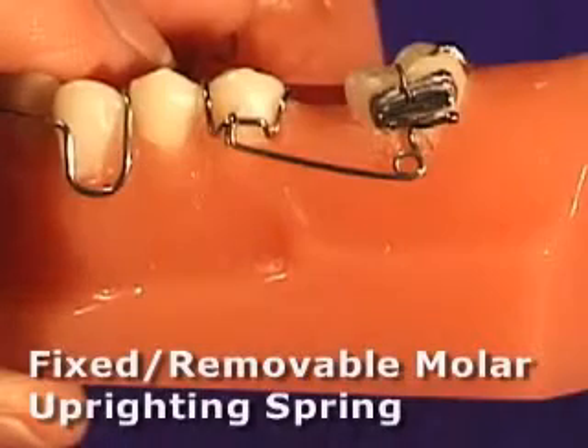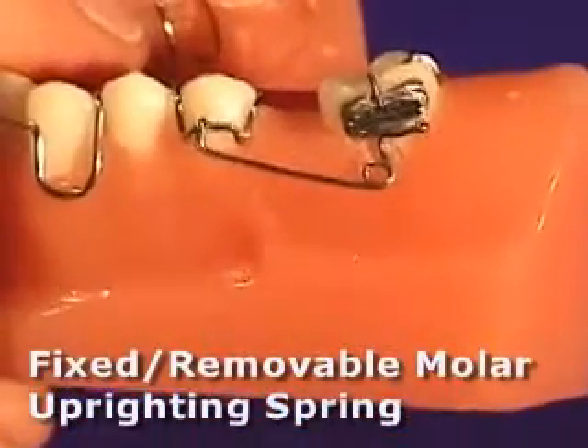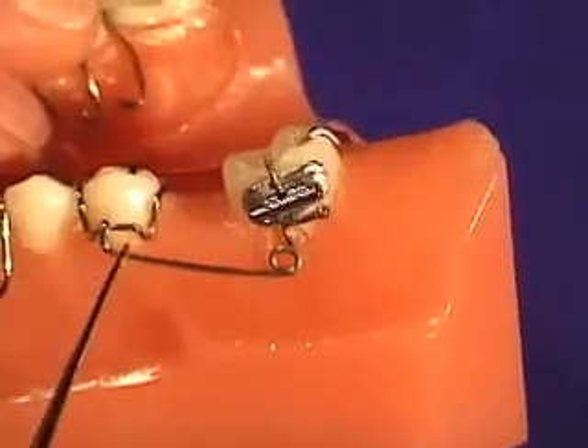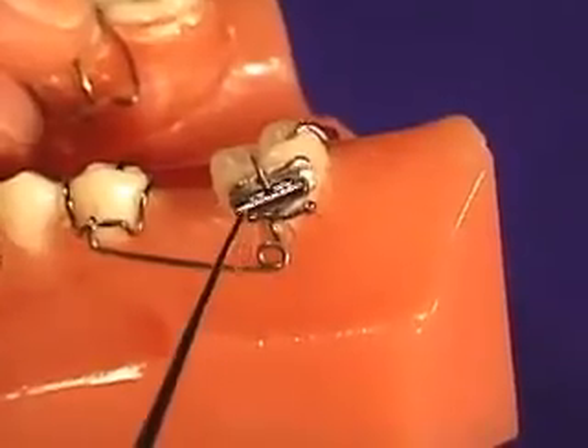The molar uprighting spring is designed to be used with a buccal tube cemented to the buccal surface of the molar and a removable appliance, so it is a combination type appliance and spring. The spring generates force to the molar via this helical coil which goes through a vertical slot on the molar tube.